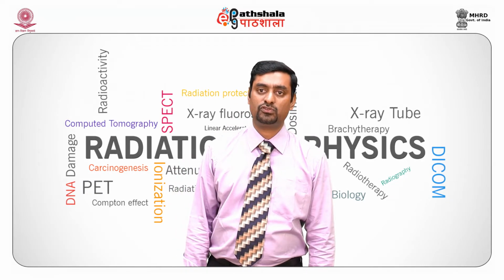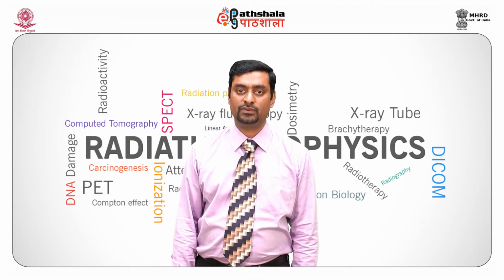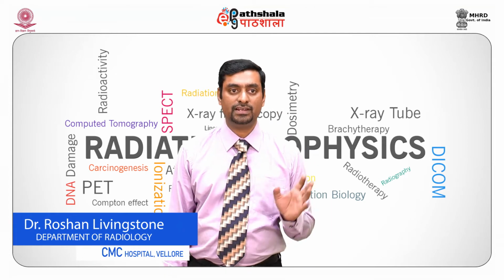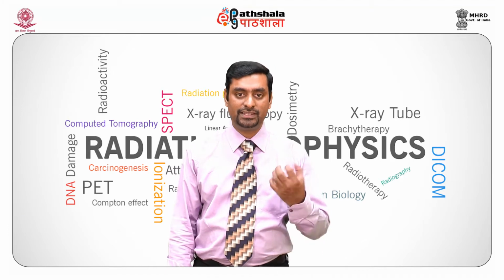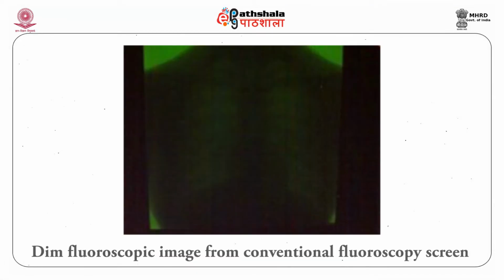The earlier conventional fluoroscopy machines had dim fluoroscopic images, and that requires a dark environment. So eyes have to get adapted to the dark environment. When you go into a fluoroscopic room, all the lights are switched off. Finally, the eyes get adapted to this dark environment. It takes about 5 minutes. After that, we see this dim fluoroscopic image as seen in this image. A thin lead glass is placed behind the fluorescent screen for radiation protection purposes.